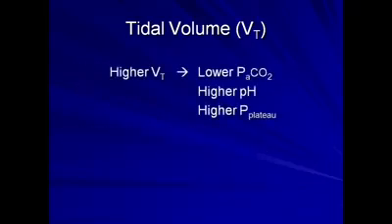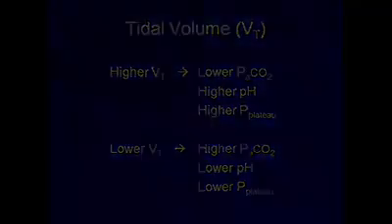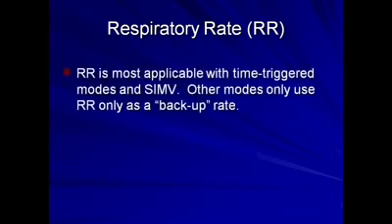As a general rule, higher tidal volumes lead to lower PaCO2s, higher pH, and higher plateau pressure, while lower tidal volumes lead to the opposite. Next is respiratory rate. This is most applicable with modes that have time-triggering function, such as assist control and SIMV. Other modes, such as pressure support ventilation, only use this value as a backup rate in the event of apnea.